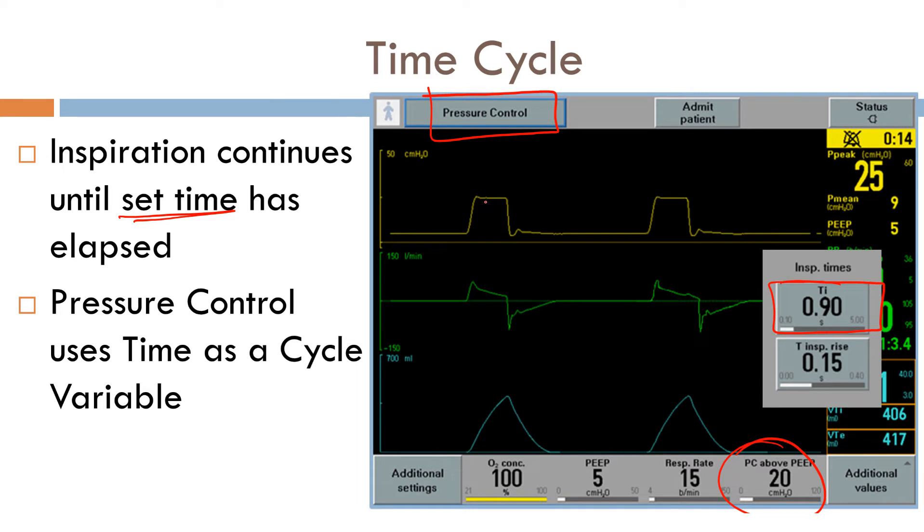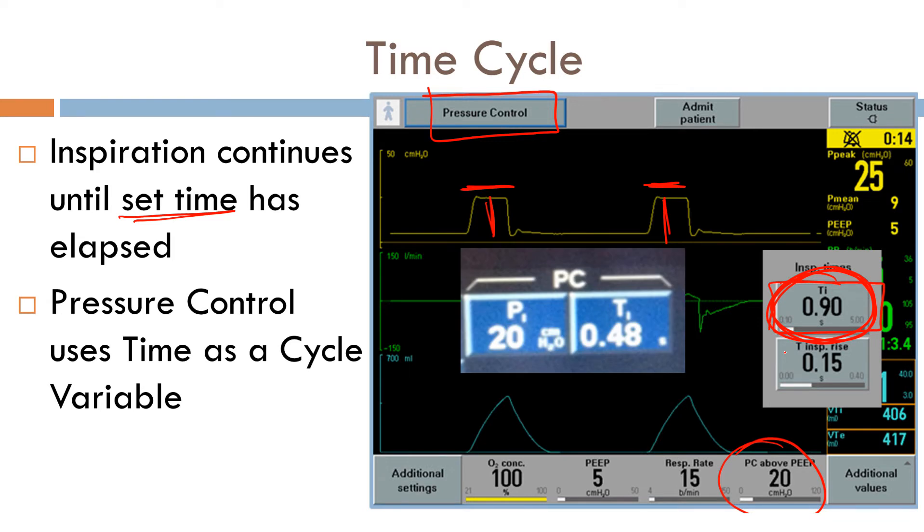So here we can see the amplitude is exactly set. This is our target variable pressure. It's exactly the same. However, the duration of each breath is exactly the same. Why? Because each breath is exactly 0.9 seconds. In the Puritan Bennett, here's your target variable. And this has set the duration or the inspiratory time to 0.48 seconds.